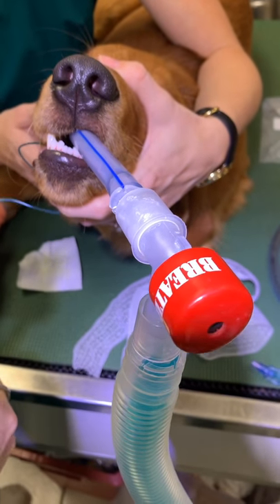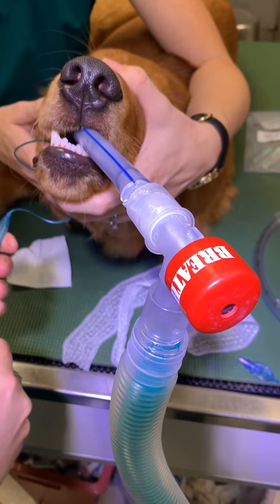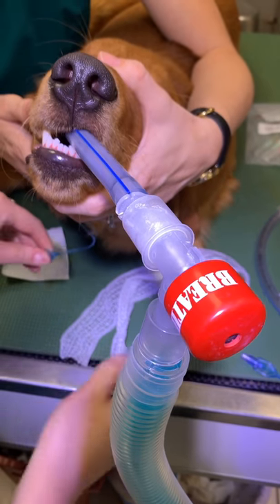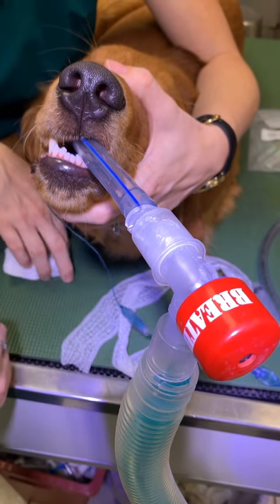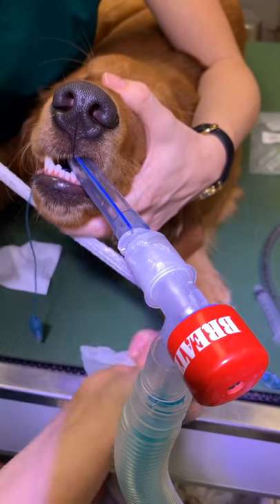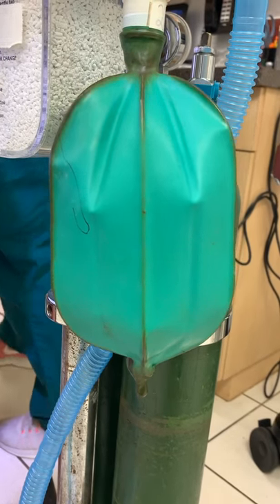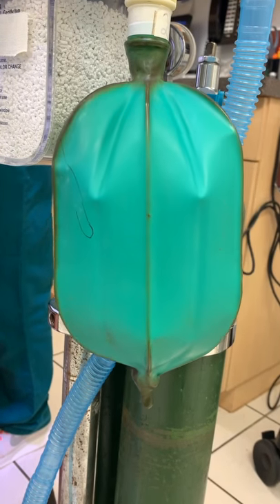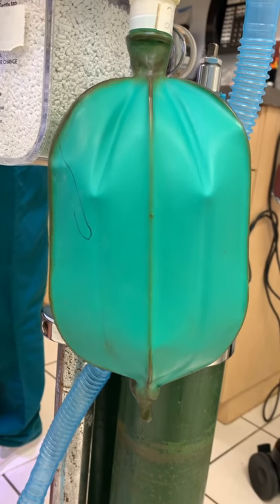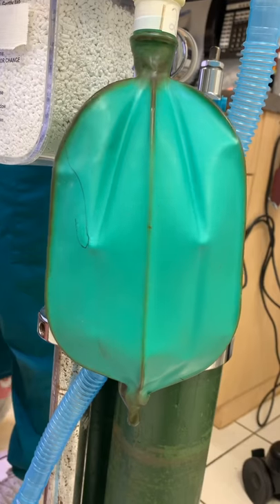We have a breathing apparatus attached to his endotracheal tube, so every time he takes a breath we will hear it with a beep. And that's an important thing. You can see that it'll beep and he'll take a breath and the endotracheal tube will fill up, showing that he's breathing nicely. The bag is filling up with each breath, and you can actually hear the breathe-right apparatus telling us he's breathing. We can also see that the bag is moving appropriately.